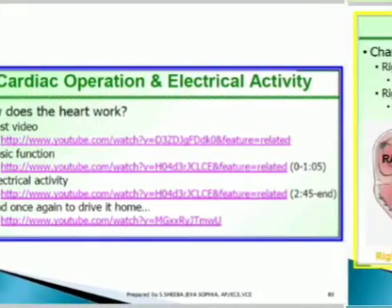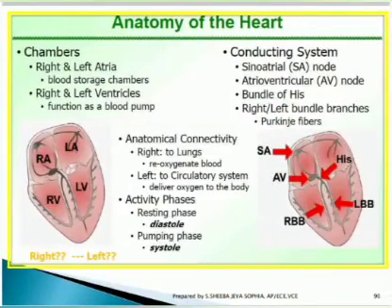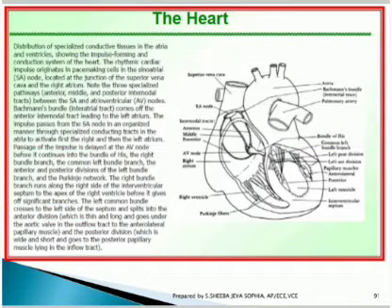Monitoring of this SA node is the major task in finding these ECG signals. First, you need to know the anatomy of the heart clearly in order to find this ECG value: the SA node, the atrioventricular AV node, and also the right ventricle and left ventricle. These are separations where different values of the heart pulse are measured individually. So a lead system is used to measure this variety of pulses at a variety of positions of the heart.